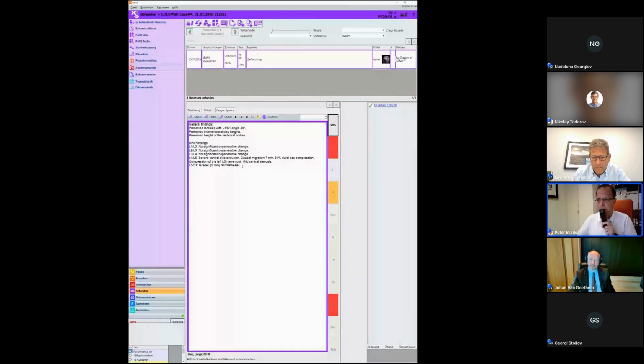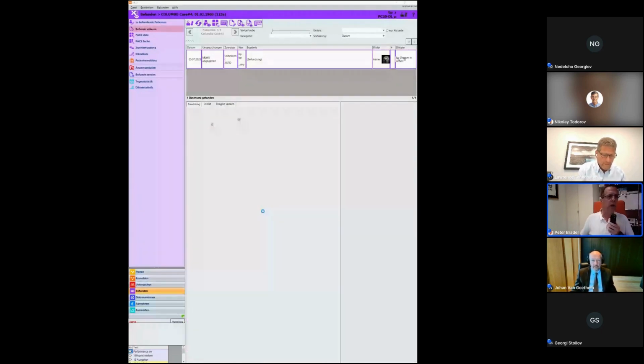Our software is working in German, so unfortunately I cannot dictate in English, but I can write something here. And then the report is ready. I close it. Hopefully it works. Yes, I close it, and the report is gone.